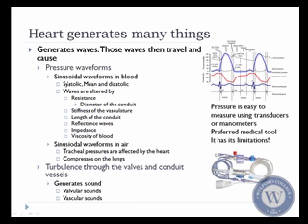So mean arterial pressures and mean venous pressures are by far the most accurate when you're looking at overall pressures. Now, the waves can actually be significantly altered by many things. And because these waves can be altered by many things, it can actually change the waveforms that are being generated, and that has to be taken into account.